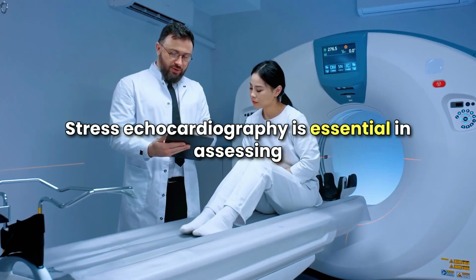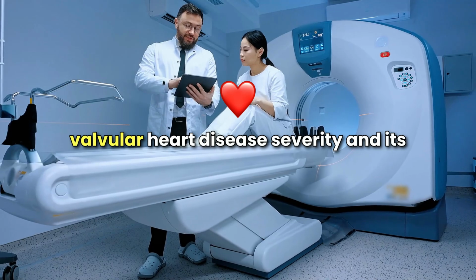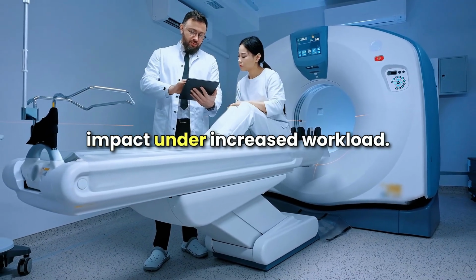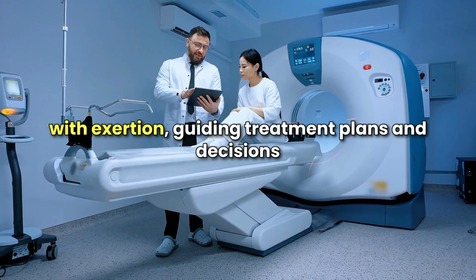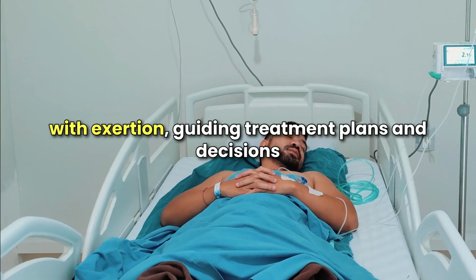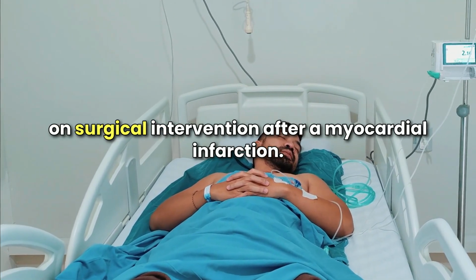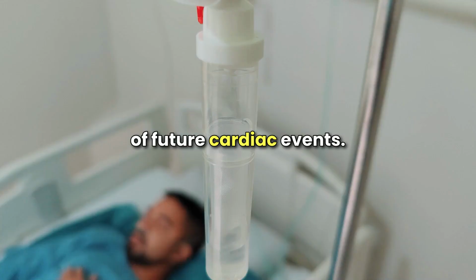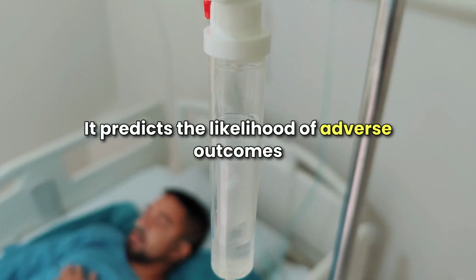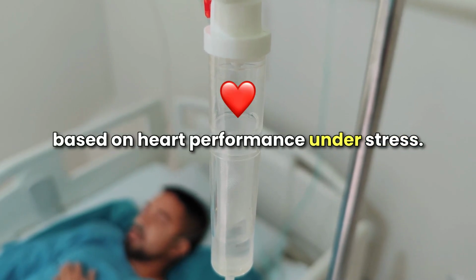Stress echocardiography is essential in assessing valvular heart disease severity and its impact under increased workload. It helps determine whether valve dysfunction worsens with exertion, guiding treatment plans and decisions on surgical intervention. After a myocardial infarction, stress echocardiography stratifies the risk of future cardiac events. It predicts the likelihood of adverse outcomes based on heart performance under stress.